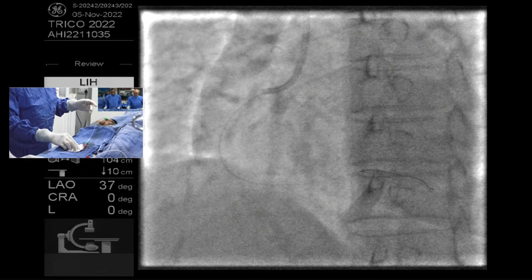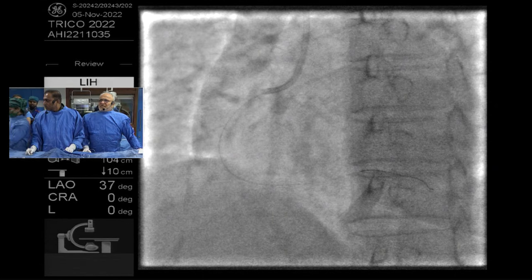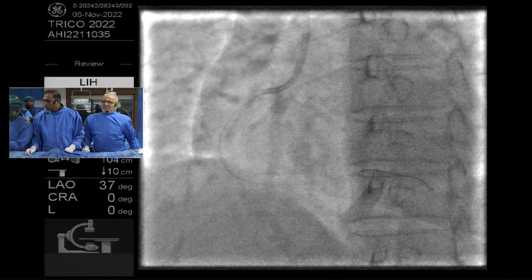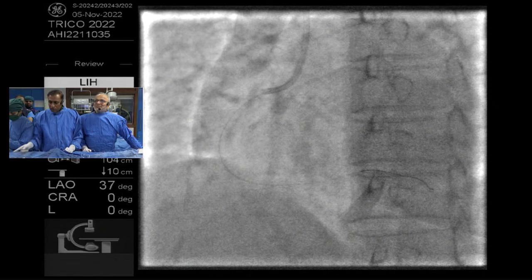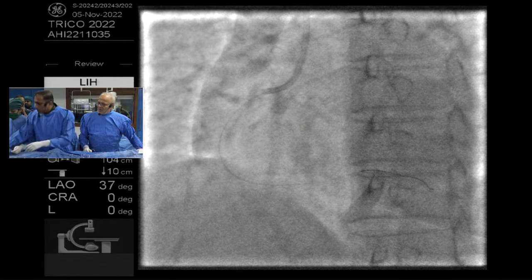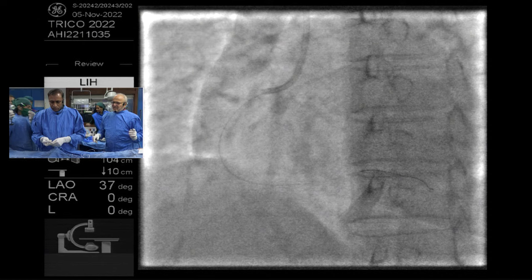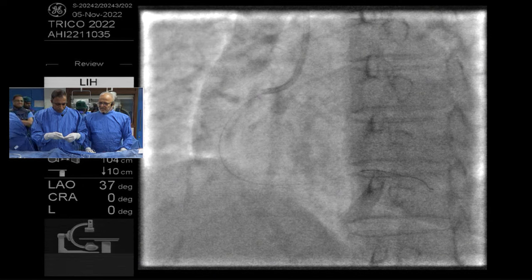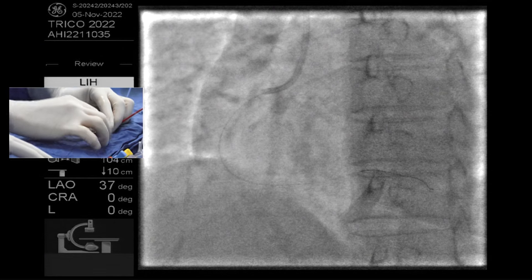We are doing a study where we simultaneously run OCT and IVUS, and run them on two screens for Dr. Akasaka to interpret both simultaneously. OCT definitely works better for understanding the pathology, but let's see. By that time they will prepare the OCT.